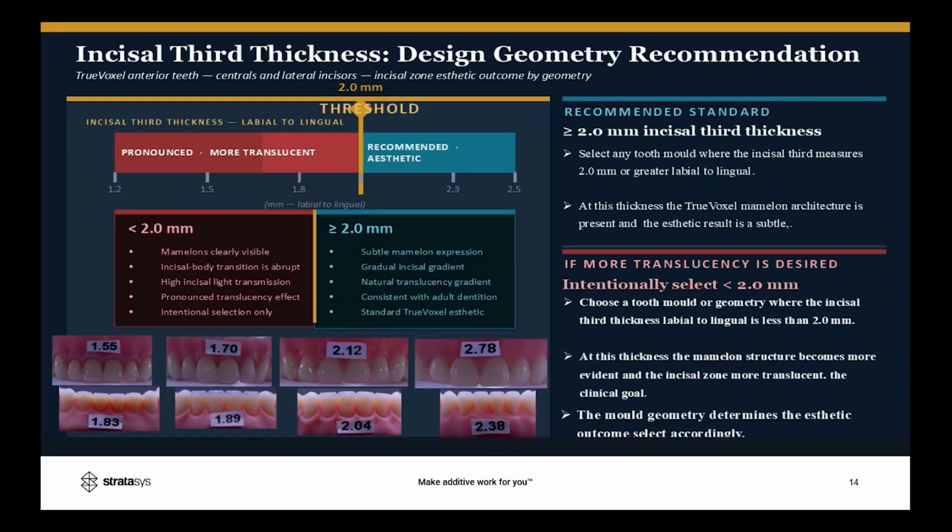This slide really is from a little bit of research we did. I said we did a number of iterations, looking at the correlation between geometry and the tooth structure. So we can create these internal structures, but through machine learning, understanding different geometries, from us and from our industry colleagues. Can somebody? Okay, thank you.